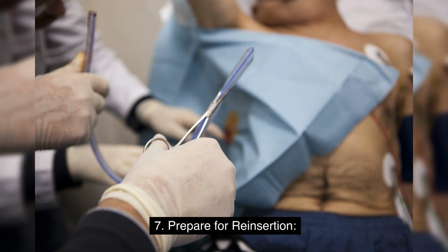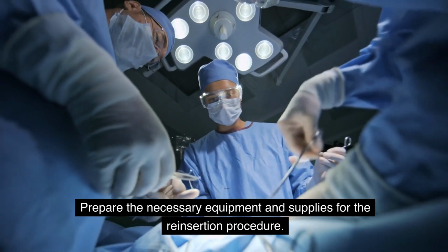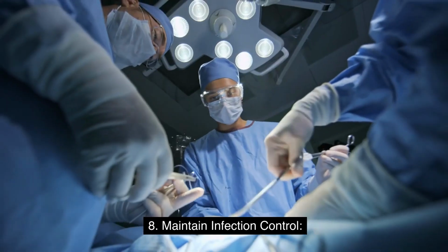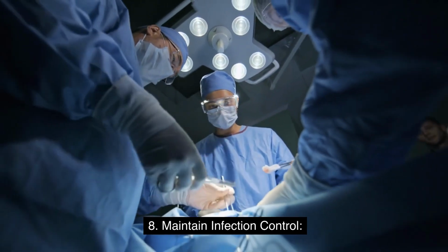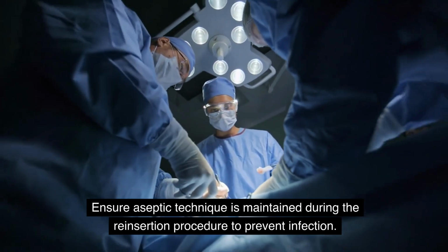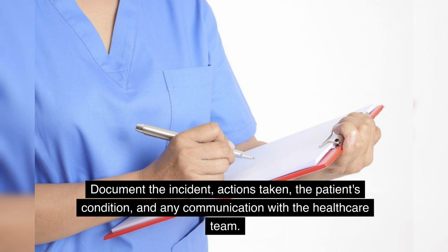7. Prepare for reinsertion. The patient will likely require a new chest tube or reinsertion of the dislodged tube. Prepare the necessary equipment and supplies for the reinsertion procedure. 8. Maintain infection control. Ensure aseptic technique is maintained during the reinsertion procedure to prevent infection. 9. Documentation. Document the incident, actions taken, the patient's condition, and any communication with the healthcare team.